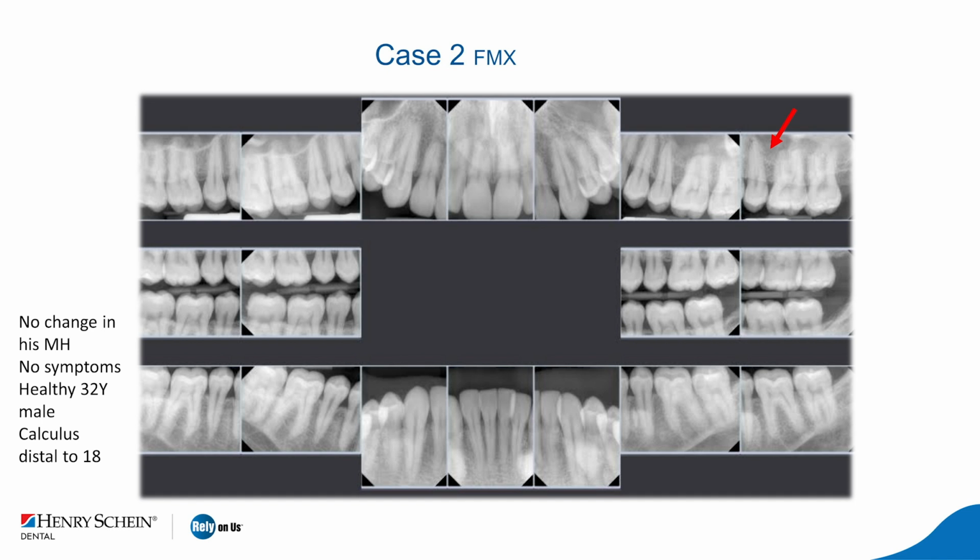And there is opacification also, but it's difficult to assess the opacification on that exam. I will agree. But when you see that the floor of the sinus is missing and you see opacification within the soft tissue, well, then again, it raises a red flag that needs to be well assessed. And in that case, it was again a squamous cell carcinoma after biopsy of the left maxillary antrum. So always look for all of the structures.